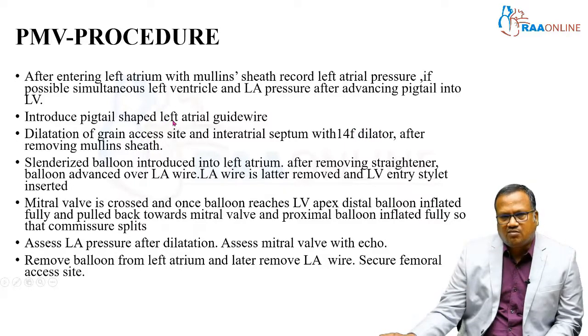So before dilating, you make sure that you have punctured septum correctly and there is no pericardial effusion, and then once you dilate, then you give heparin.